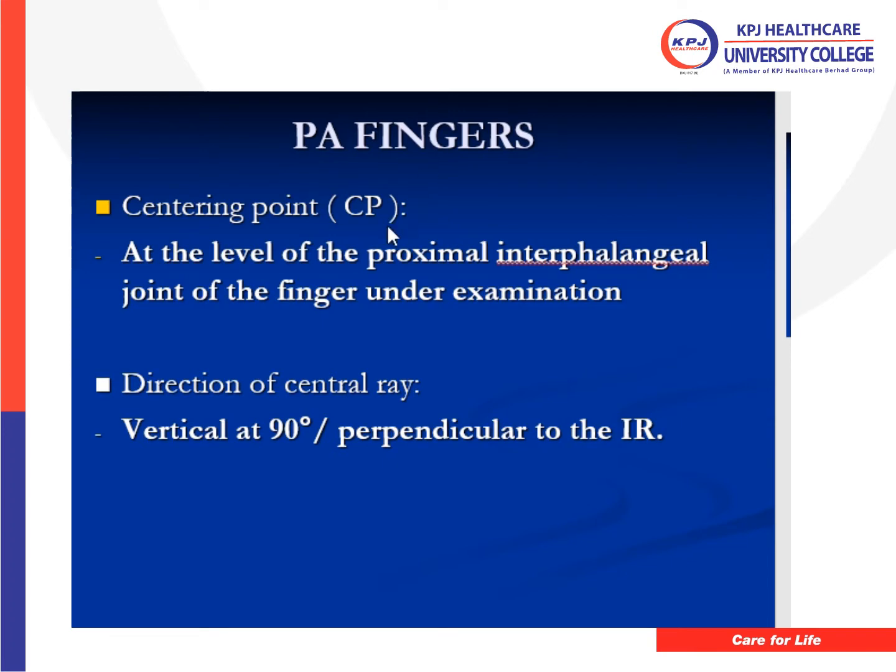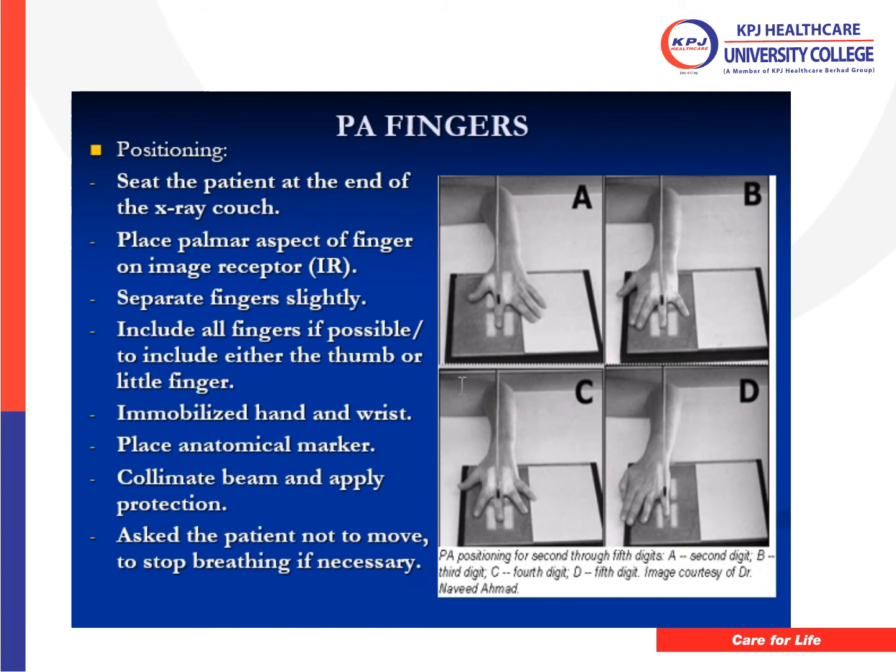Centering point, as I said before, is at the level of the proximal interphalangeal joint of the fingers, and it is always perpendicular to the image receptor, or vertical at 90 degrees to the image receptor. So, proximal interphalangeal joint.